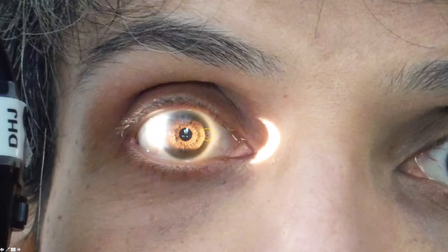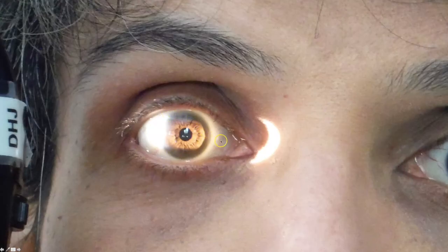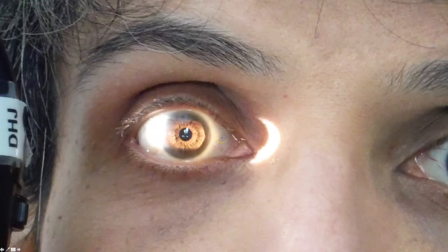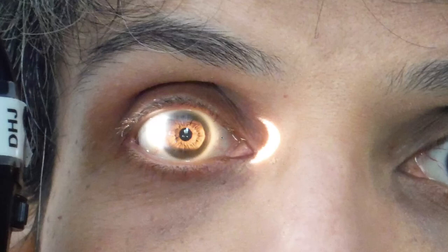This implies that the entire iris is sitting flat in the coronal plane and is therefore safe to dilate the pupil for fundoscopy.